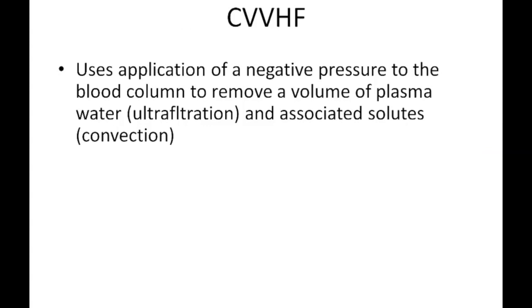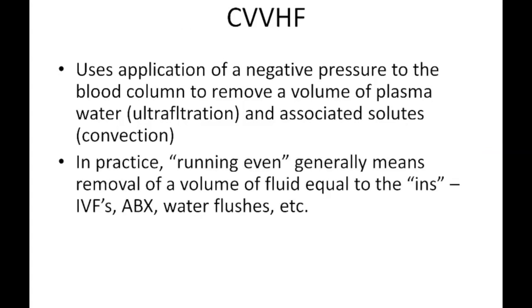And this again is just a definition of convection and ultrafiltration. You apply a negative pressure. Some machines do, others would put a positive pressure in the blood component of the cartridge of the filter. That basically causes a filtrate of plasma water to be removed, and it does drag some solutes with it. That's convective clearance down there. You'll often hear the term running even. If you go to the ICU and ask the ICU nurse, how much fluid are you taking off this patient? Well, we're running even.